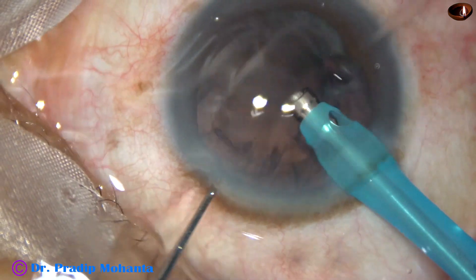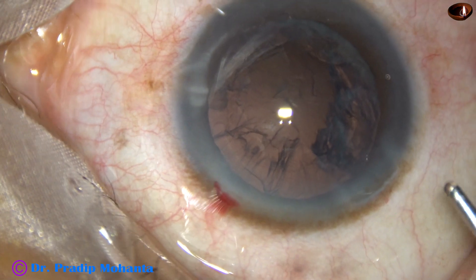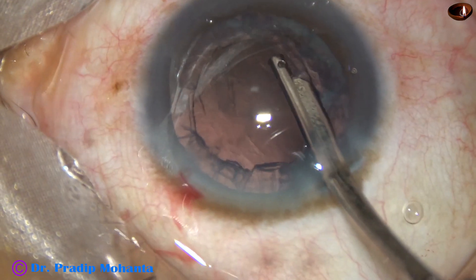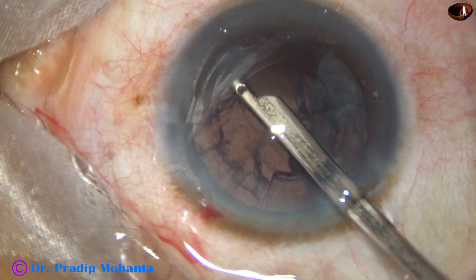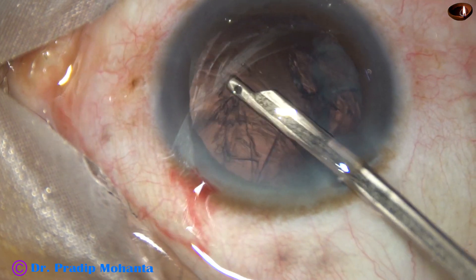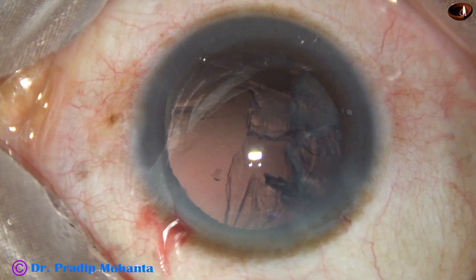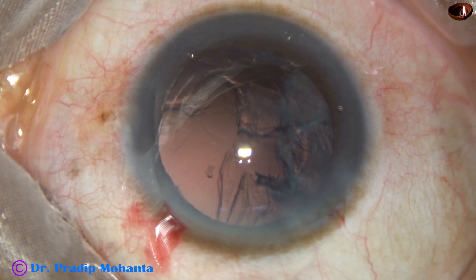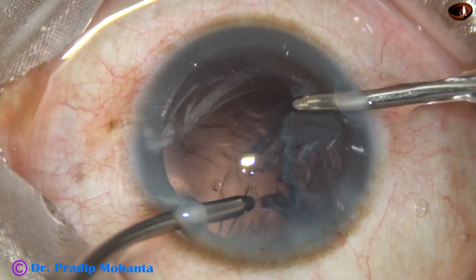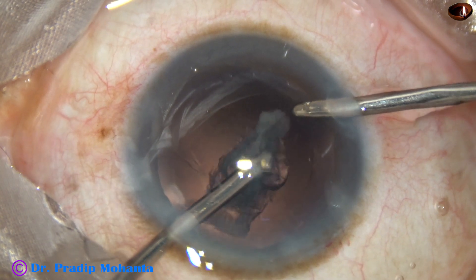And now, 2% HPMC is injected again. By the time bimanual irrigation aspiration gets ready, I can remove some cortex from the inferior part without going through the side ports. Almost 50% of cortex has been removed. Now, bimanual irrigation aspiration is ready — irrigation goes from the right side, aspiration from the left. And in no time, the cortex is removed.